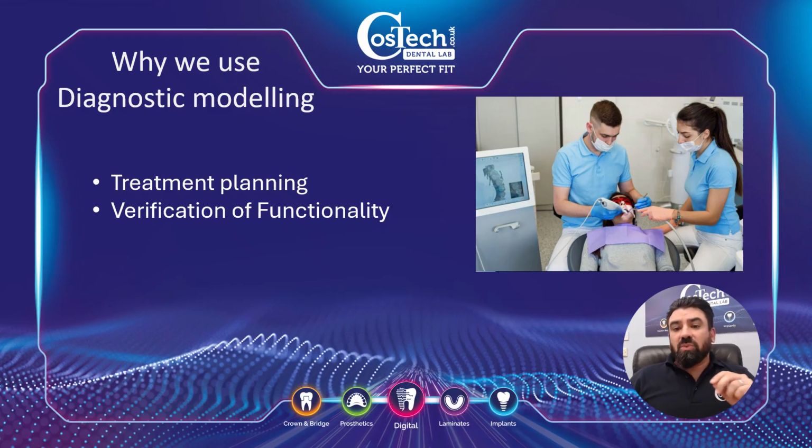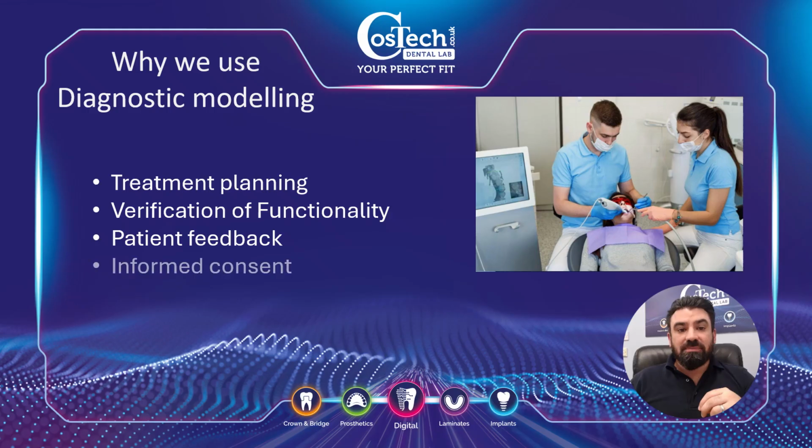The main thing that we want to do, before any treatment commences, is make sure that if the patient has a certain amount of aesthetics in their mind of what they want to achieve, the functionality isn't compromised, and if it can be enhanced, even better. And also it actually brings the patient into the loop of the actual design process.